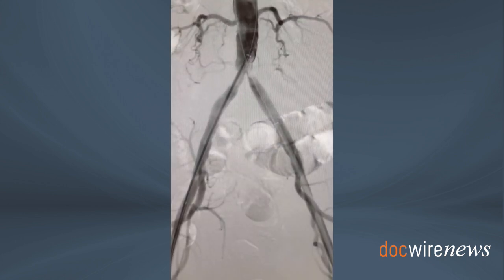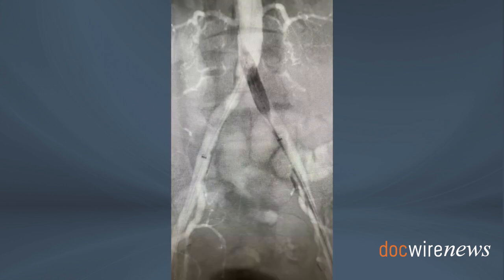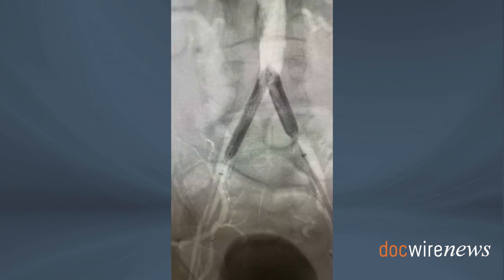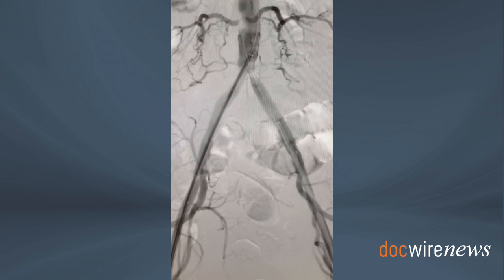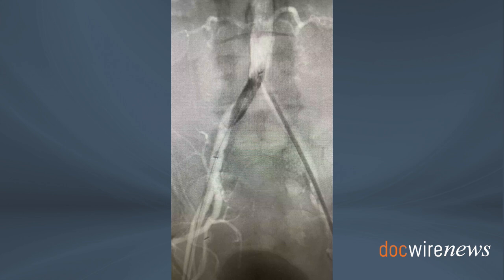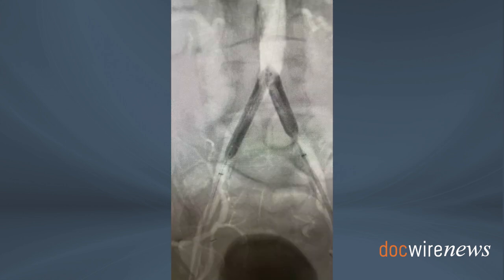Since the right common iliac artery was severely diffusely diseased and had to be covered in its entirety, and we did not have a 10 by 58 millimeter covered stent on the shelf, and we only had two 10 by 38 covered stents, we decided to place a 9 by 58 millimeter covered stent on the right and a 10 by 38 on the left, then post-dilate the right with a 10 millimeter balloon.